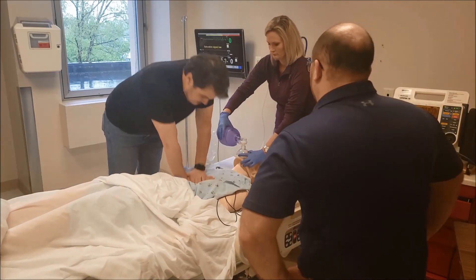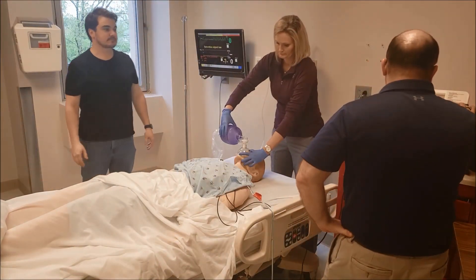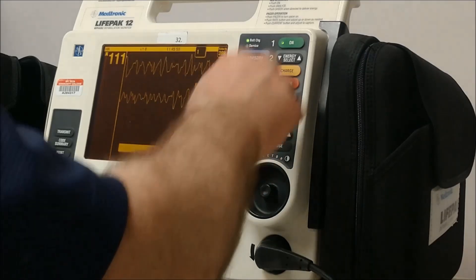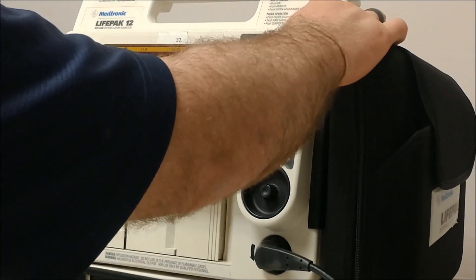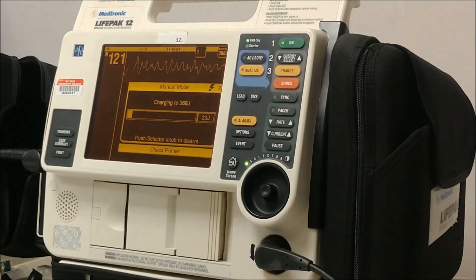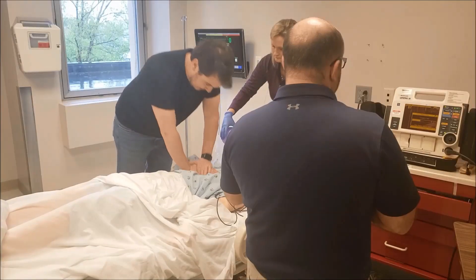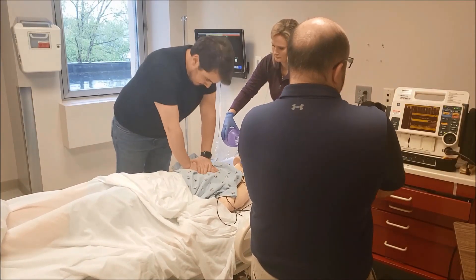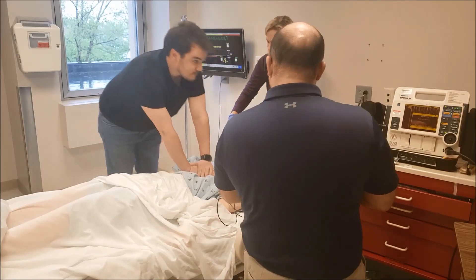It's been two minutes. Hold CPR, reassess. We still seem to be in V-fib of some type. Let's increase our energy — start CPR again, we're going to charge at 360. V-fib needs a defibrillator. We're charging 360, clearing the patient — I'm clear, you're clear, we're all clear. Shock delivered.